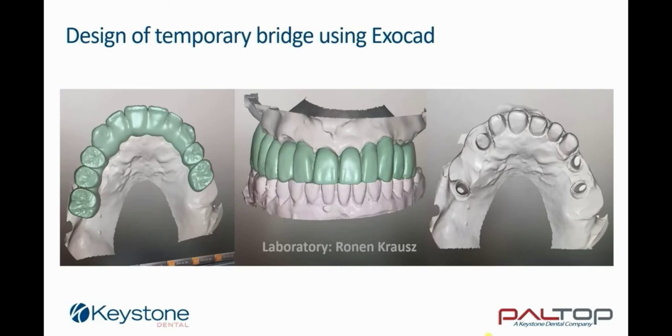The distal segments of this bridge will seat on the abutment copings. The anterior segment will seat on the prepared teeth. Following osseointegration of the implants, a final bridge will be delivered in 3 segments.